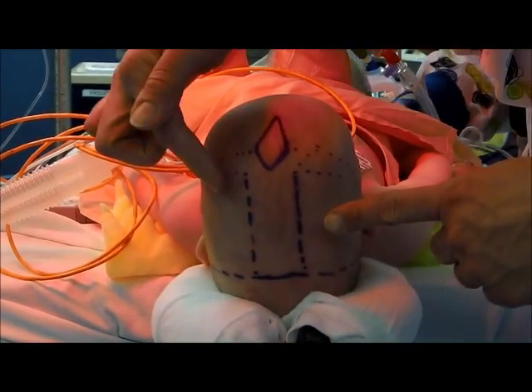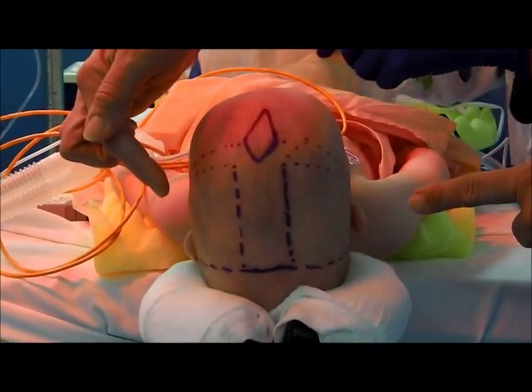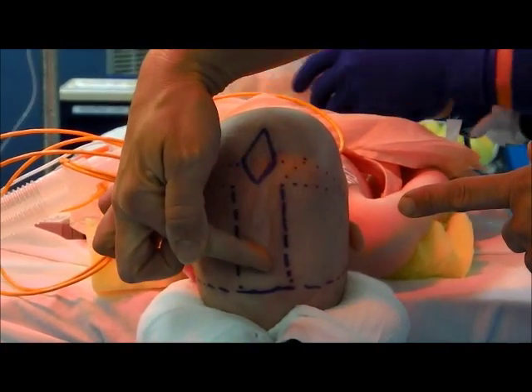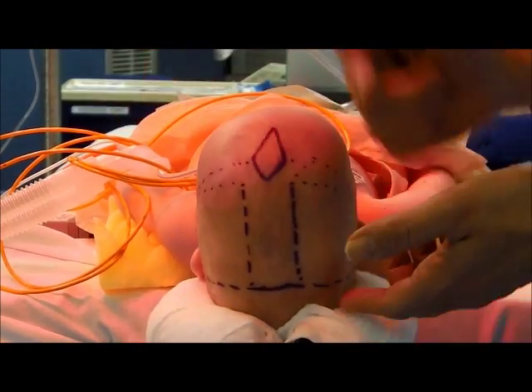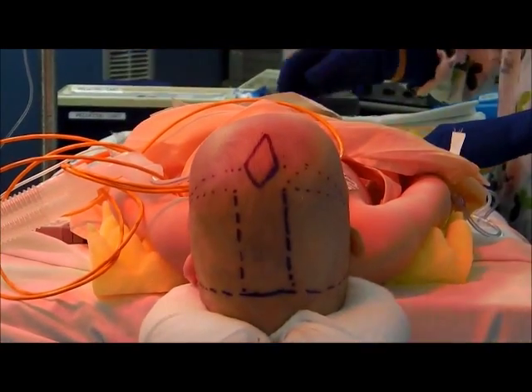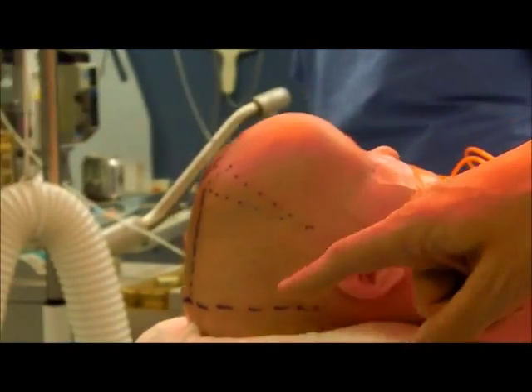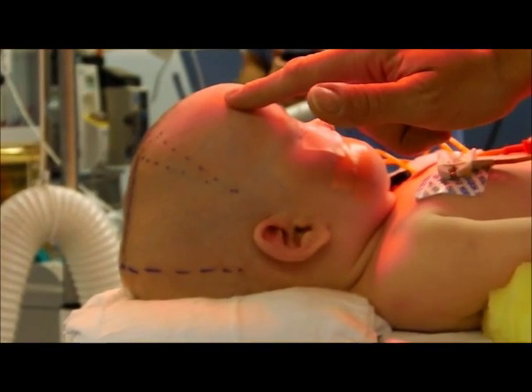This allows us to mobilize the parietal bones out laterally to give the baby's head extra width, because when the sagittal suture fuses, as it did in this child, the head shape is very narrow and very long. As you come around to the side, you'll notice the baby's head is very long in the anterior-posterior orientation, and the baby has developed some frontal bossing.